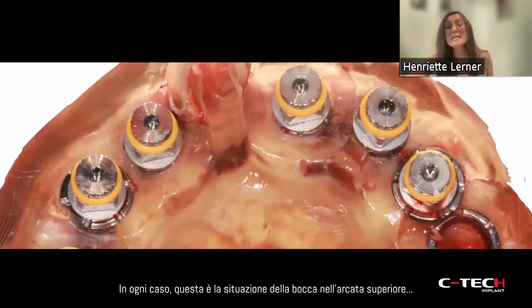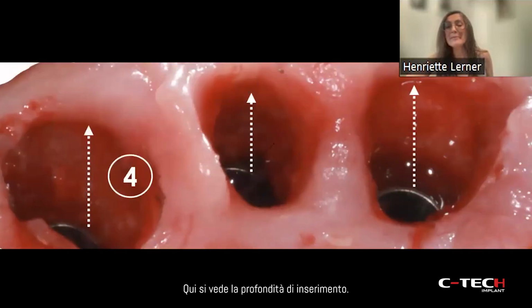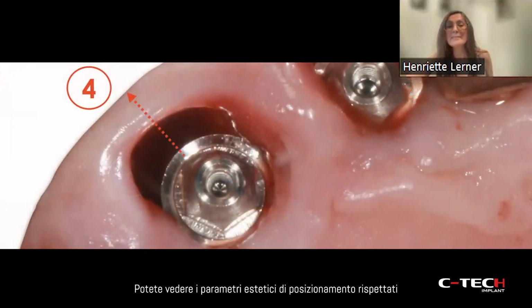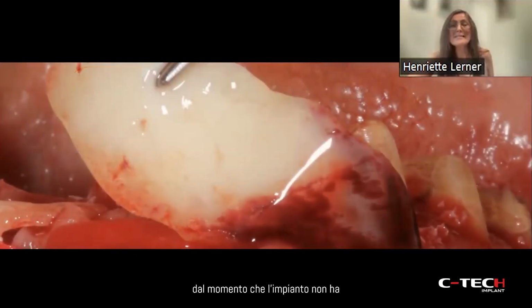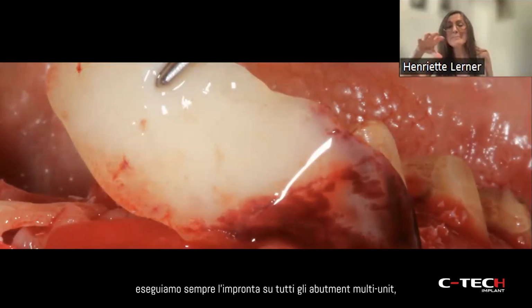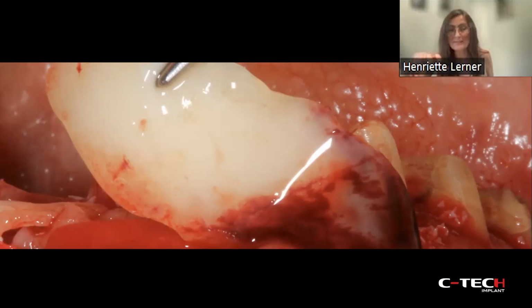Well, nevertheless, this is the situation in the mouth, in the upper. This is the depth of the insertion. You see the aesthetic parameters of placement respected also in this case. And the multi-unit abutments. Since the implant has a more tapered conical connection, we always make the impression on multi-unit abutments in order to fix that and not to have any vertical discrepancies.